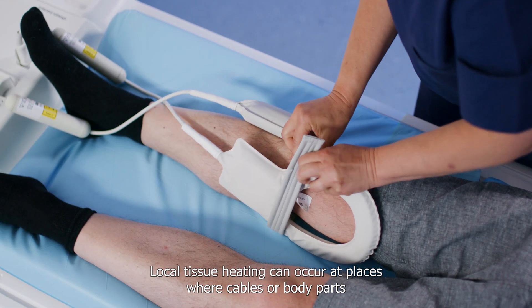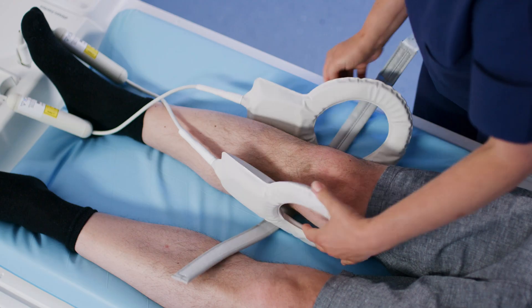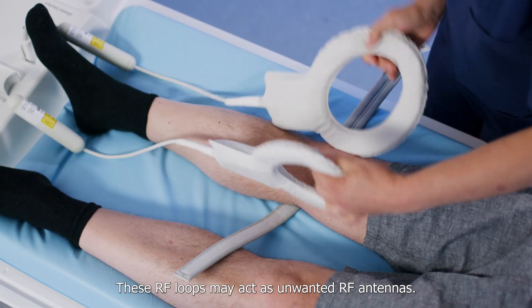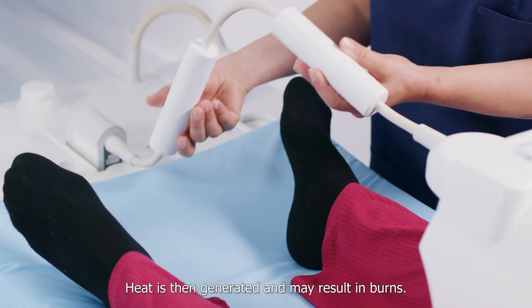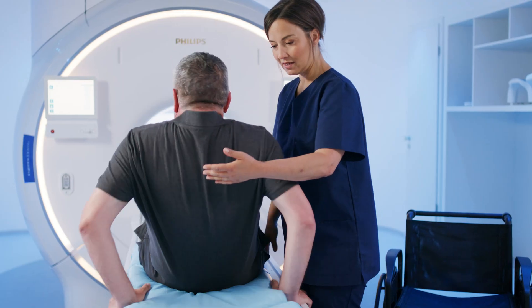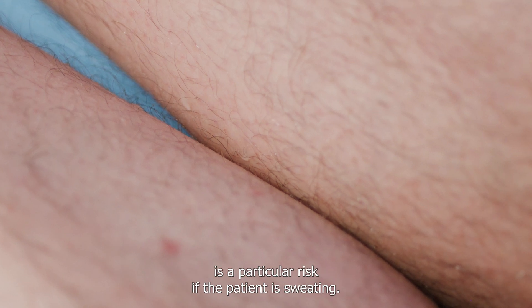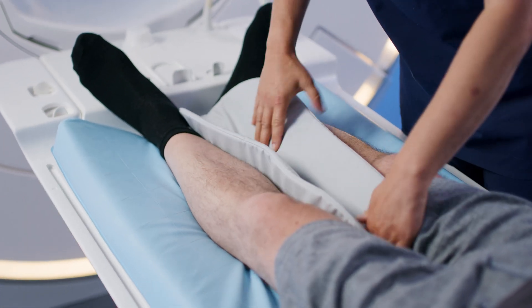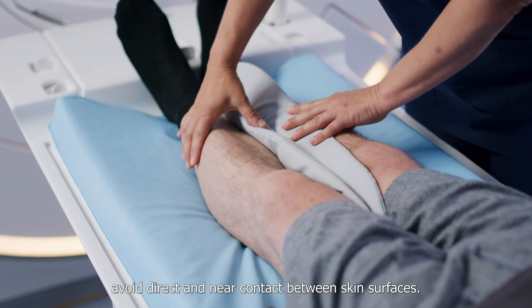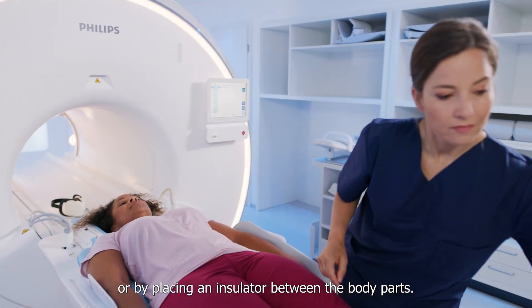Local tissue heating can occur at places where cables or body parts connect in a manner that creates resonant induction loops. These RF loops may act as unwanted RF antennas. The electrical resistance is high if the area where the RF loop closes is small, and heat generated may result in burns. The unwanted antenna effect caused by skin-to-skin contact is a particular risk if the patient is sweating, as moist skin has an increased burn risk. To prevent skin-to-skin RF heating incidents, avoid direct and near contact between skin surfaces by ensuring space between body parts or placing an insulator between them.